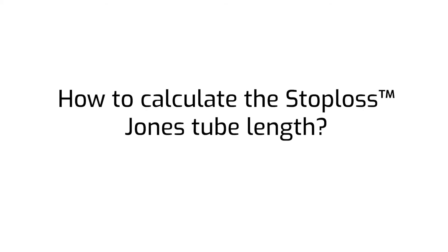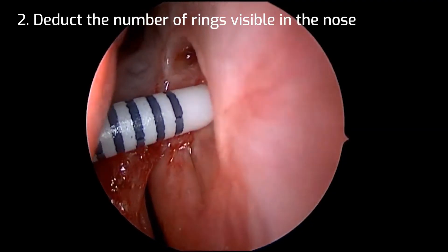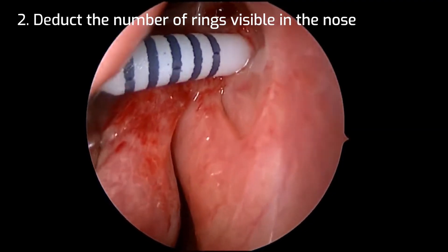In order to calculate the optimal tube length, this calculation should be followed. Take the known dummy tube length that was used, either 15 or 20 millimeters, and deduct the number of rings visible in the nose.